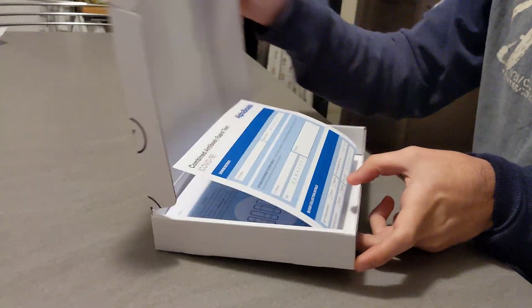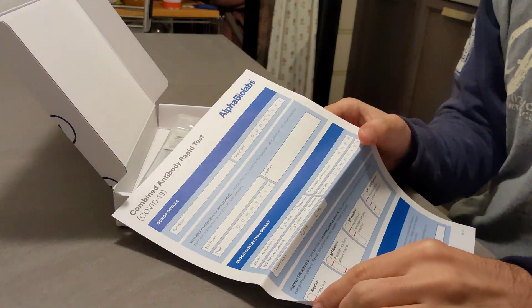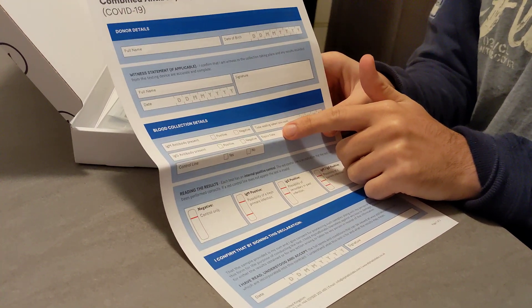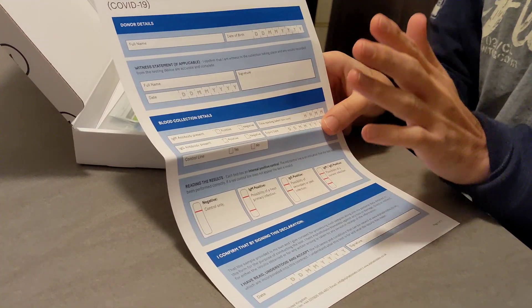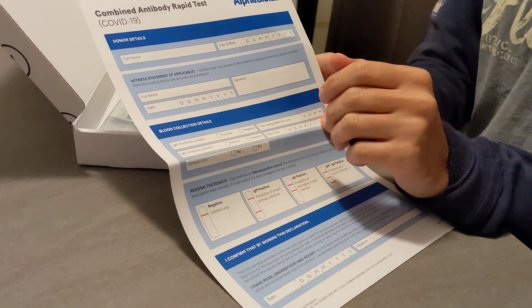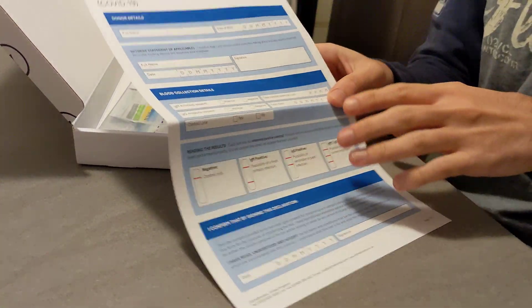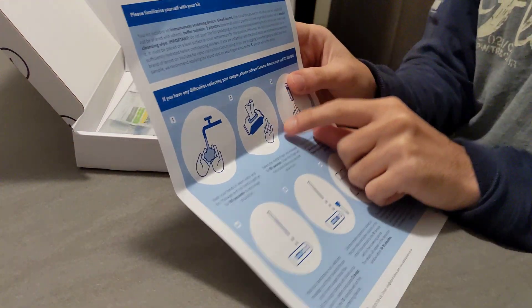If you open it, what you're going to find inside is a form. This form is going to be shipped to your local GP or to the NHS so that it's going to be counted. It's going to provide full details like your full name and so on, and also the instructions.